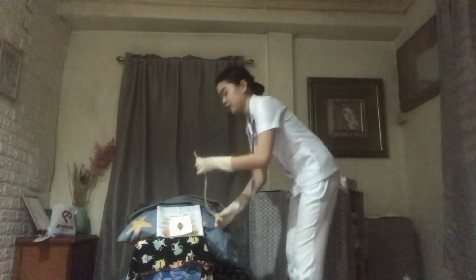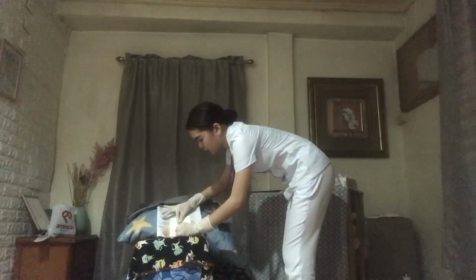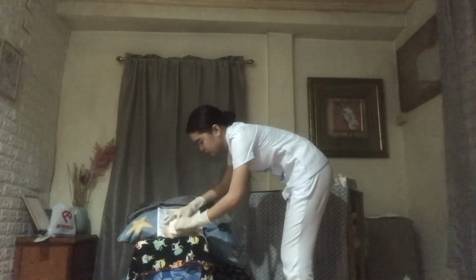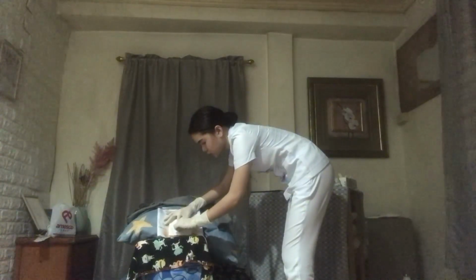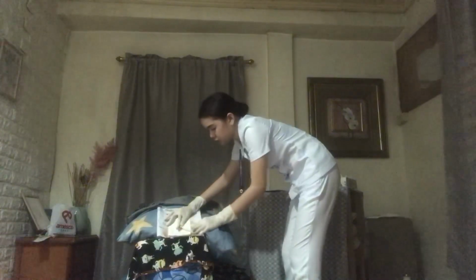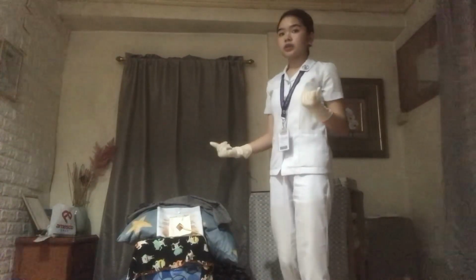So I will insert the catheter into the urethra, holding the labia. Insert for approximately 1.5 inches. Okay, so if a specimen is to be collected, pinch the catheter with the thumb and finger while placing the specimen container in position.